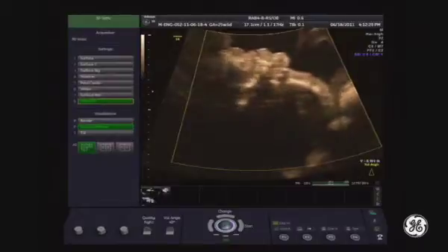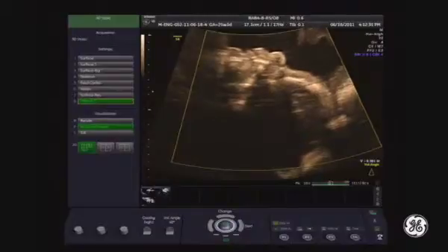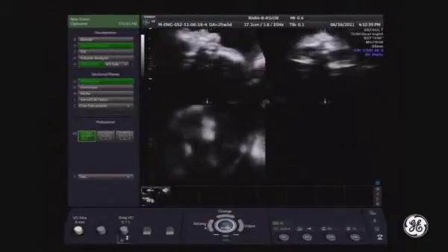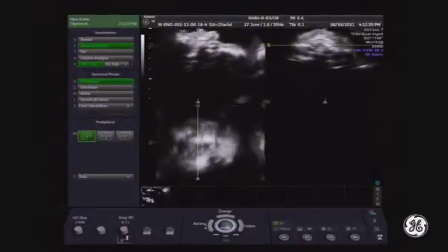I'm trying to have this insonation from the mandibular side, and I release the acquisition trigger to get the acquisition of the palate. My multiplanar view has fixed slice option, so we have VCI slice of the thickness of 20 millimeters. I reduce the size of it to about 2 millimeters, and I will bring my pivot point in reference image A here, and I'll make this vertically like this.